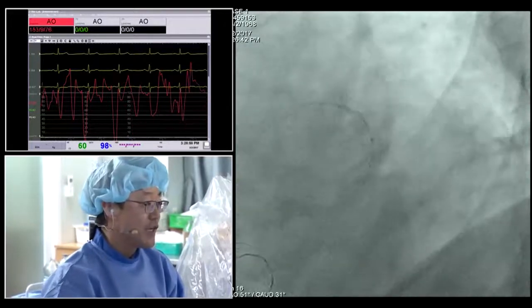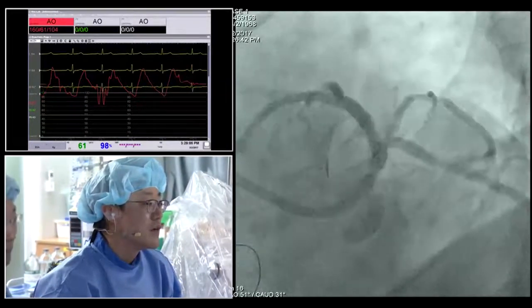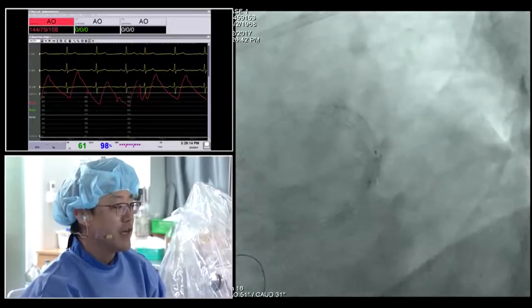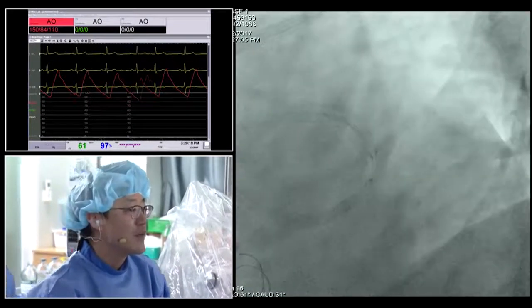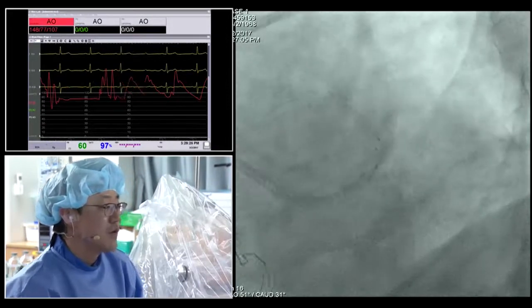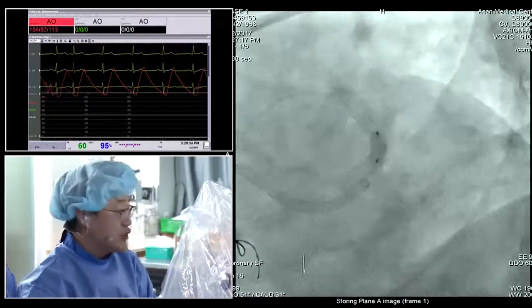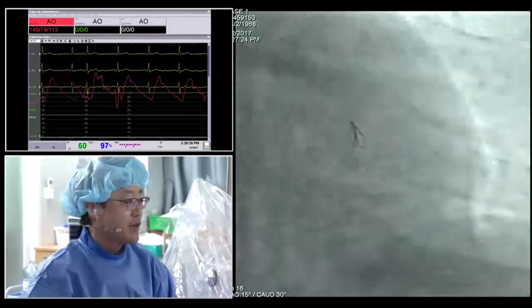This is 14, 4-0. Could you see? Okay, test it. Can you see that? Okay, go. 10, 12. This is 4.0, 4, 10, 12. Non-compliant. Yeah, okay. Hyperinflation, right? You know the POT technique, the proximal optimization of the main. Okay, one more. 10, 12, 14. Okay, save. Deflate. And then we try to oppose the proximal part of the stent.